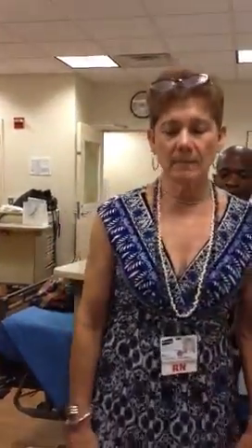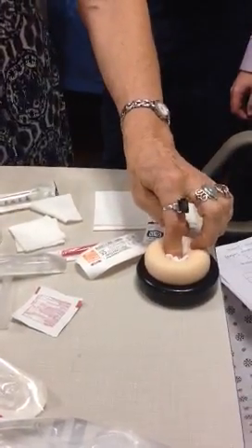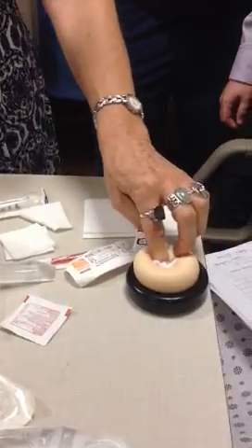So then apply pressure. You already have that here, see? So you took it out. You have that here. You just put that on while you're doing this. Okay, so you're just saving yourself. Throw it in the sharps and document. Push up. Okay. Good job, David.